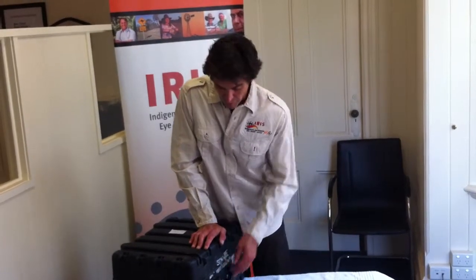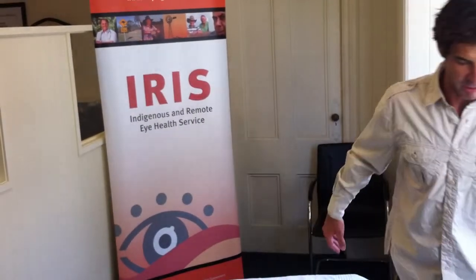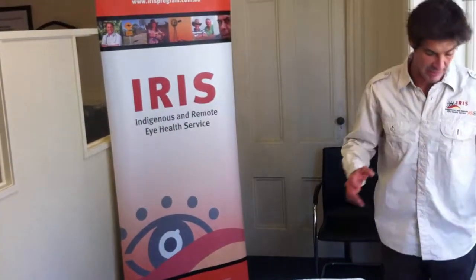That's your basic autorefractor kit. The thing you'll probably get to the cut above, where a lot of other programs are, is the ability to have a slit lamp.